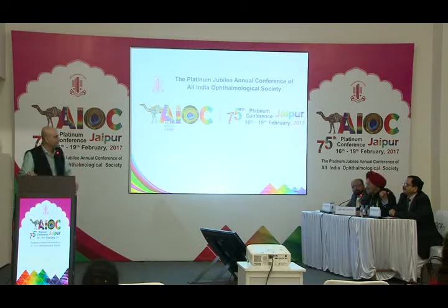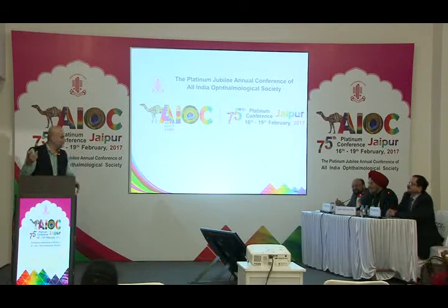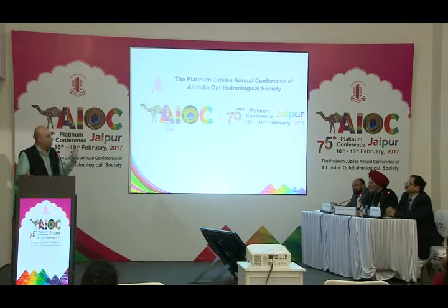What have you experienced if the lens opens upside down? What do you do? Sir, again, these are loading issues. I have only one experience with the ICL opening upside down, at a point where the OT technician gave it to me. I wasn't careful. I just pushed it down. But after that day, I load all the lenses myself when I'm doing the surgery.